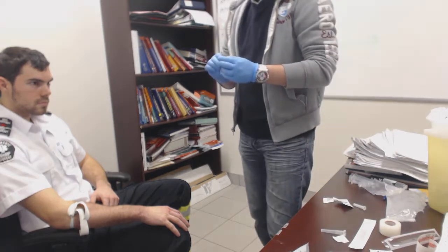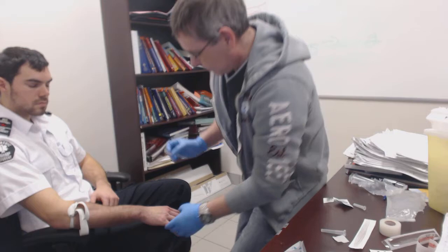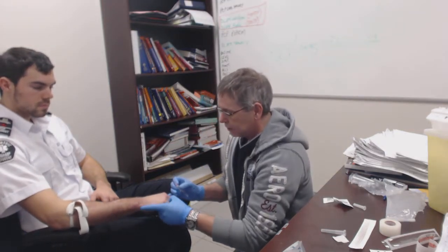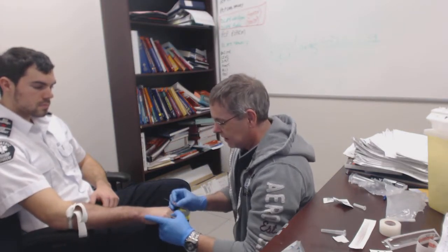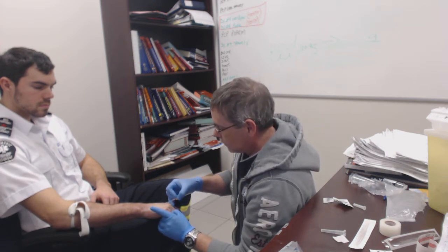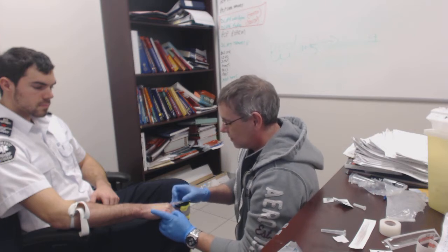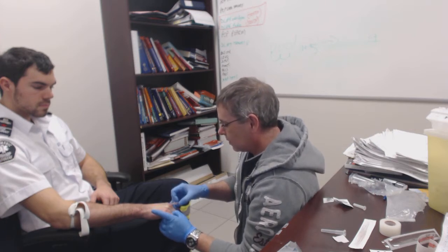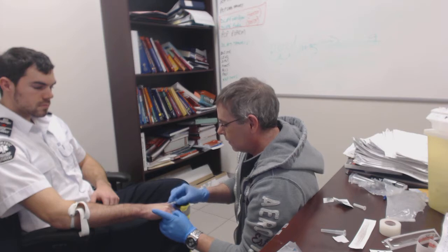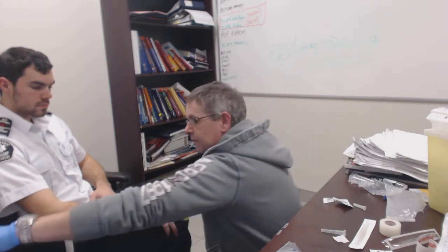So when you're going to start your IV, you always want to make sure that the bevel's up. And as you can see, the bevel is up on this IV. I'm going to pull gentle traction onto his hand so that the vein doesn't roll. And I'm going to insert at about a 30-degree angle. And there you can see I have blood coming back into the chamber. That tells me I'm in the right spot. Advance my Cathlon. Take off the tourniquet.